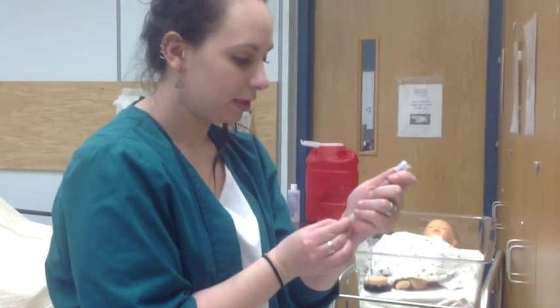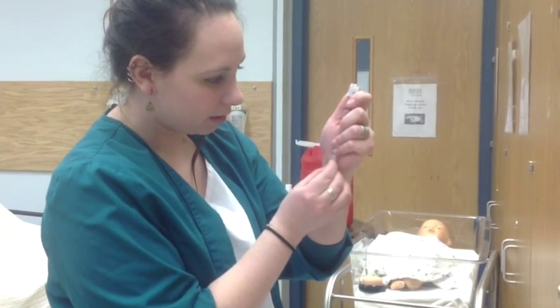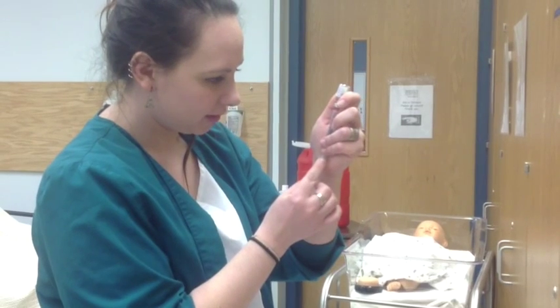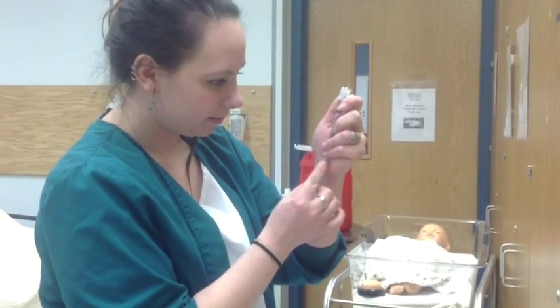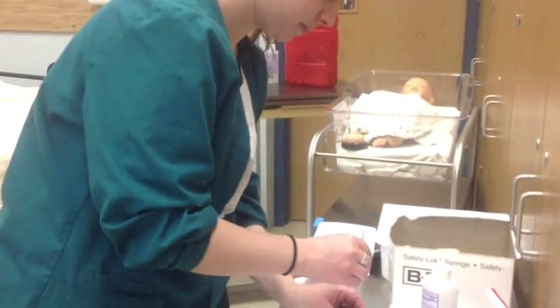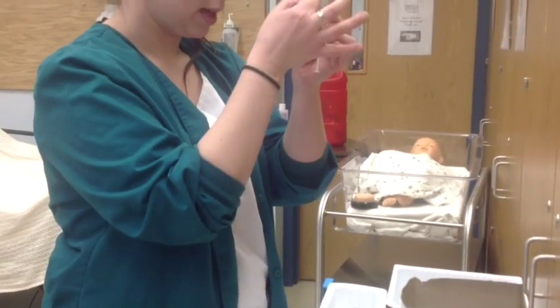And I'm going to pull down. I'm going to try not to get any air bubbles. I'm going to pull down to 0.5 mLs that I need for this vaccine. Alright. I did really pretty good. There's no air bubbles, so we're good.